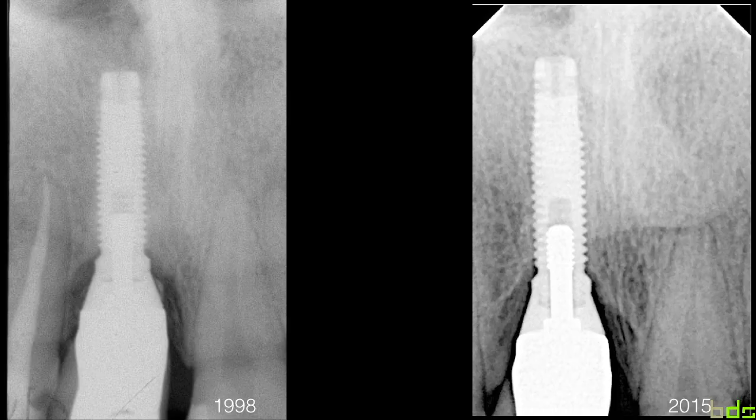This is the X-ray showing the situation in 1998. And yet 17 years later, 2015, the same situation. Knowing that this is an old Brånemark implant with external hex connection, with a machined type of surface.